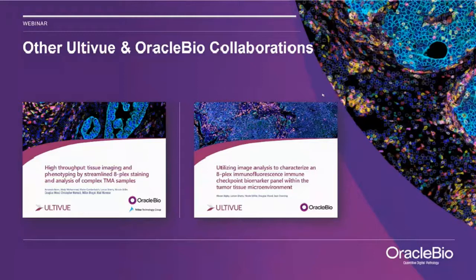And I guess that's a question for me, Angela. So yes, we always work with the whole slide imaging. I have mentioned in the beginning of my presentation that the type of fluorophores that we use are basically compatible with any type of scanner which is present today in the market, that is in the common workflows established in labs. And I think it's especially important because when we work with the tumor samples, we are aware of the heterogeneity of those samples.